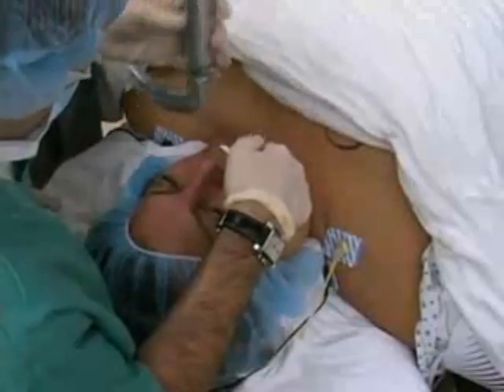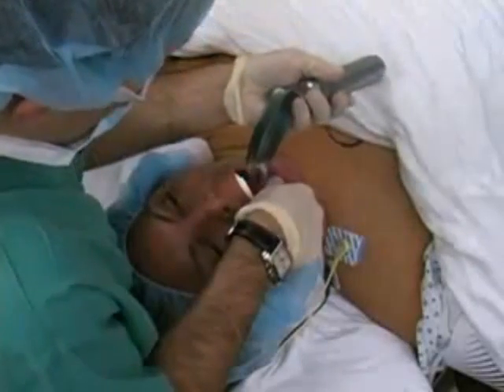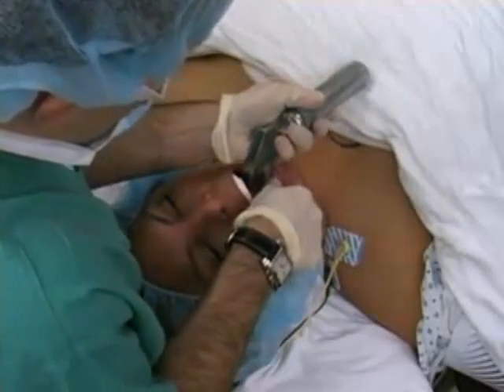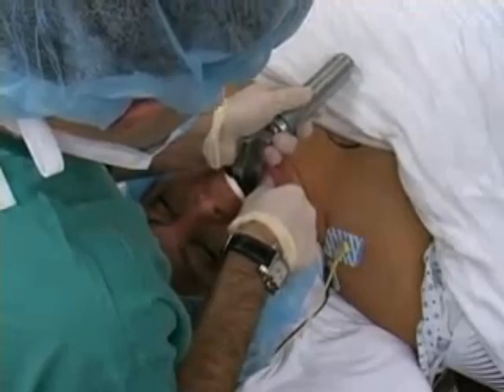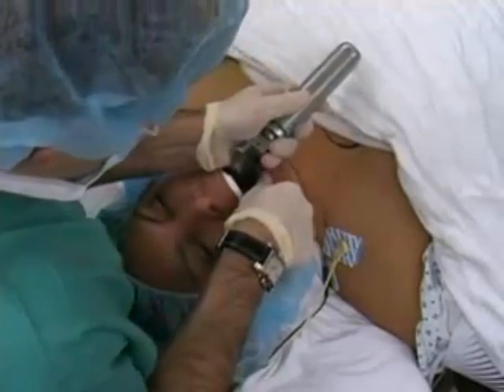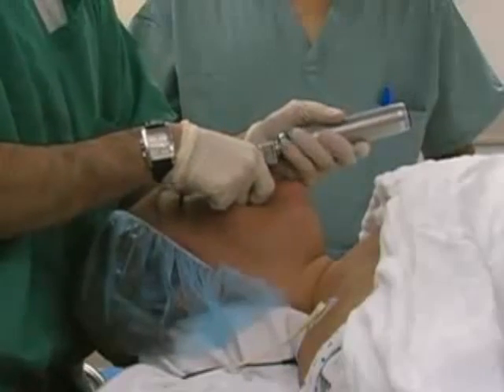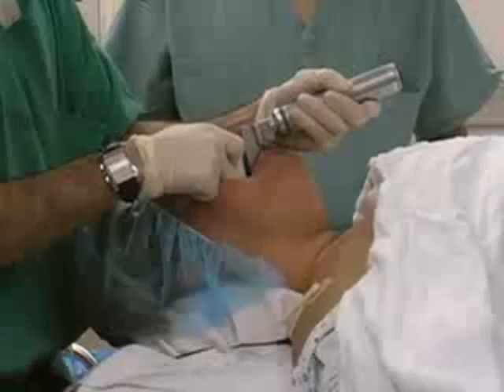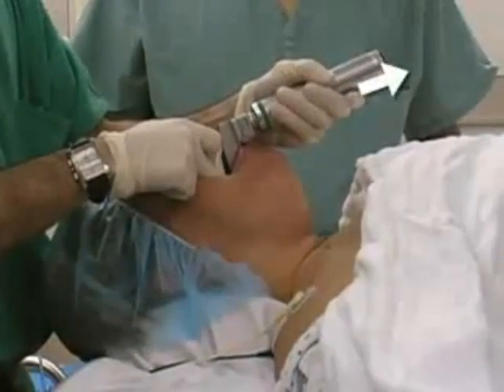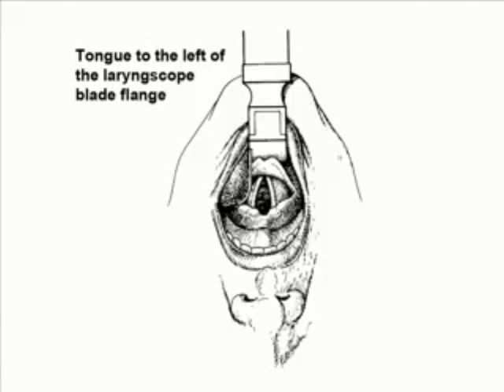With the laryngoscope blade extended, grip the distal part of the handle in your left hand. Stand at the head of the bed and scissor open the oral aperture with your right hand. Gently sublux the jaw. Insert the blade into the patient's mouth to the right of midline. Gently sweep the tongue to the left, ending the motion when the laryngoscope is aligned in the middle of the mouth. Advance the blade looking for the epiglottis and vallecula. When the tip of the blade enters the vallecula, use the handle to lift upward and outward such that the blade handle points toward the ceiling corner. Visualize the glottic opening. The Macintosh blade tip sits in the vallecula such that the epiglottis and glottic opening are visualized.